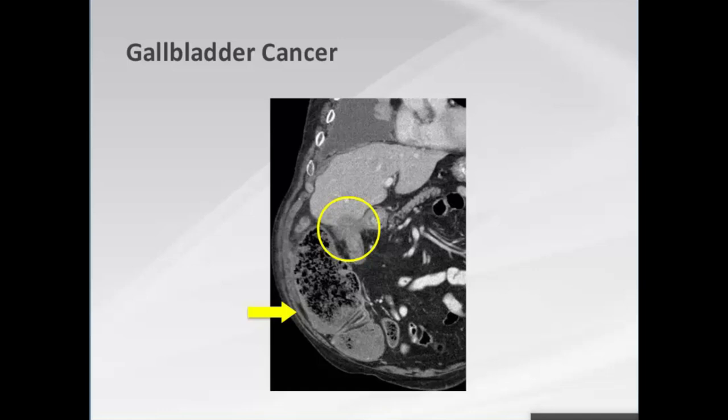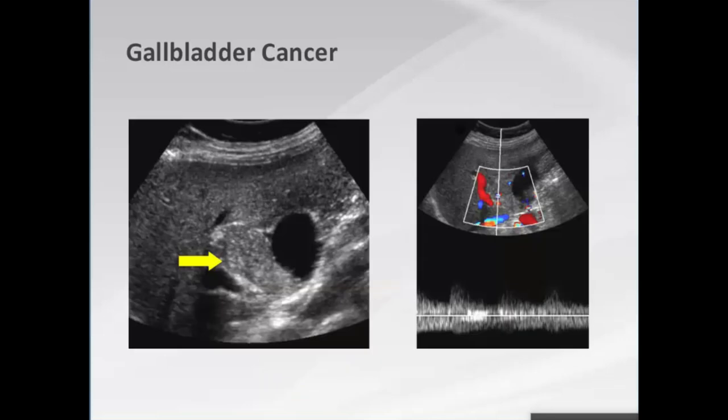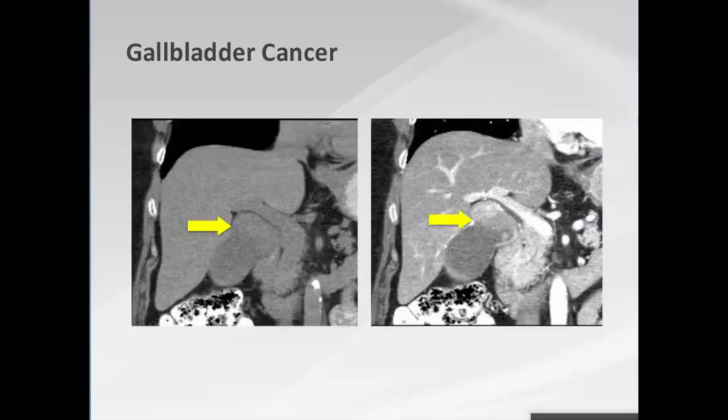Another case: echogenic material within the gallbladder neck that could be sludge, but contrast ultrasound reveals this is a vascular mass. CT for staging confirms a vascular mass — another gallbladder cancer. This patient is doing well four years post-surgery.